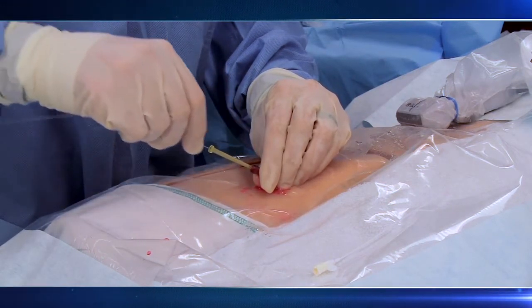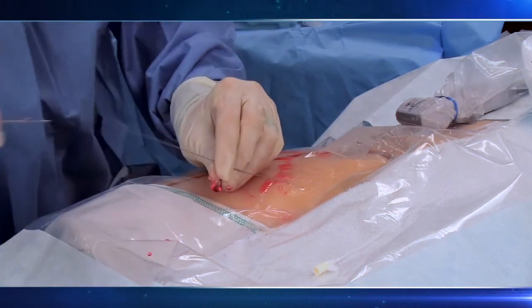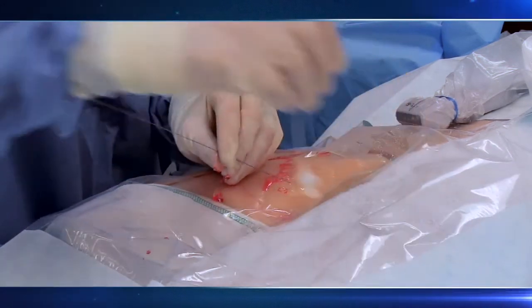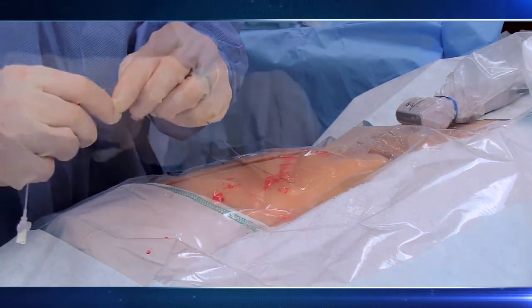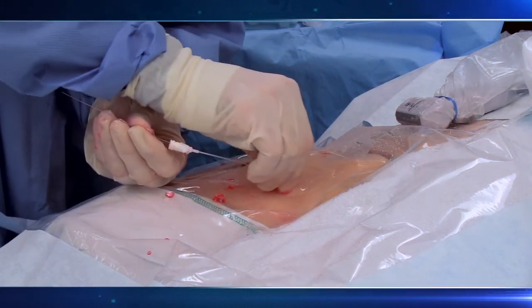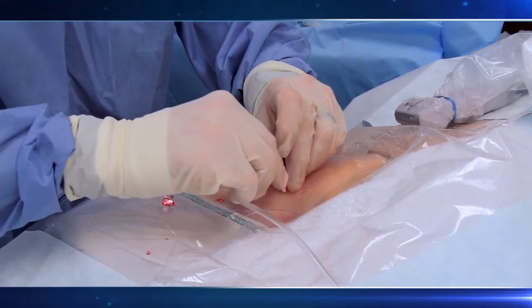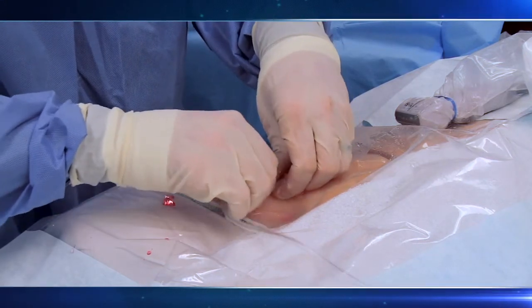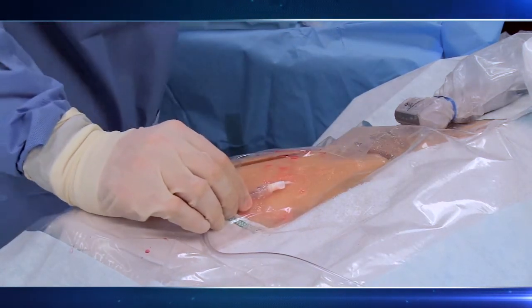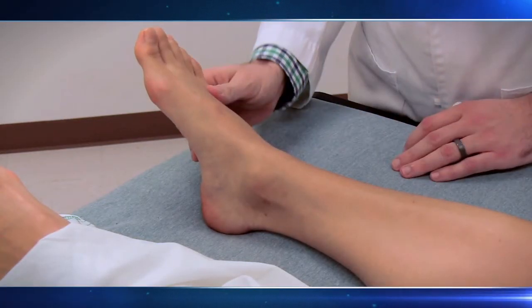Then thread the wire into the artery and remove the needle while always maintaining a firm grip on the wire. Thread the catheter over the wire and then finally connect the pressure tubing and suture the catheter in place, and cover it with a sterile adhesive dressing. Recheck for warmth and color in the extremity after the procedure, and on a regular basis thereafter, and remove the catheter as soon as it's no longer required.